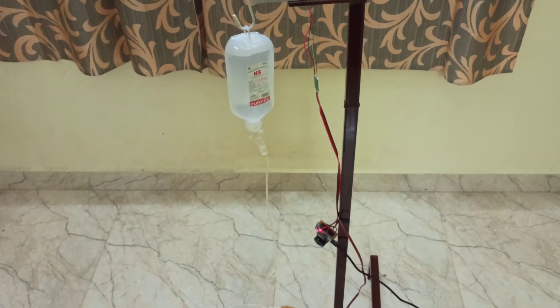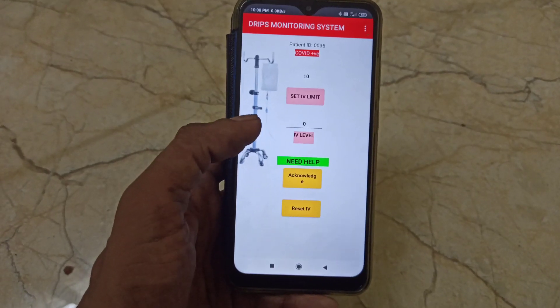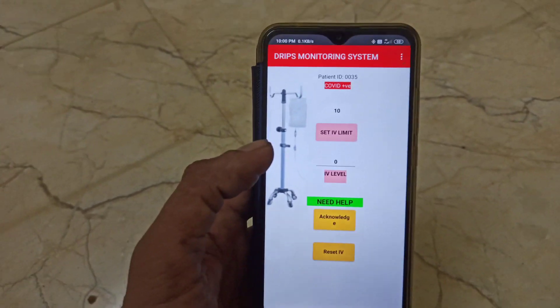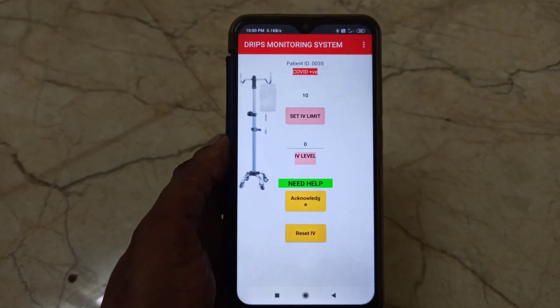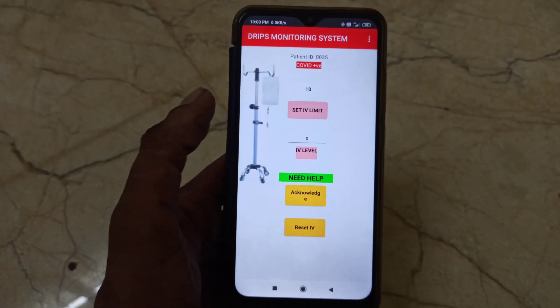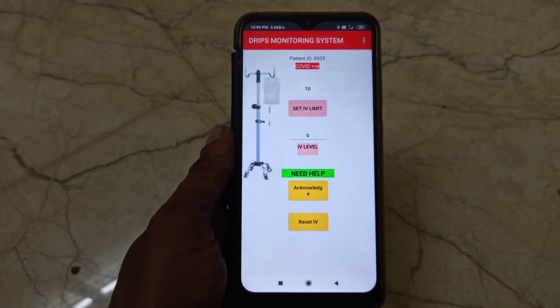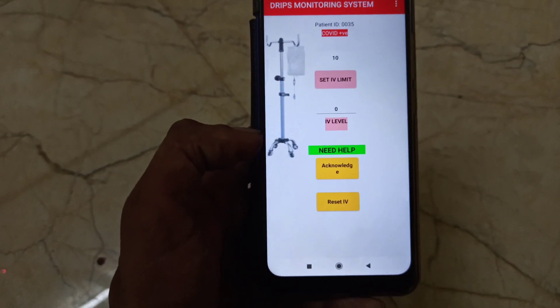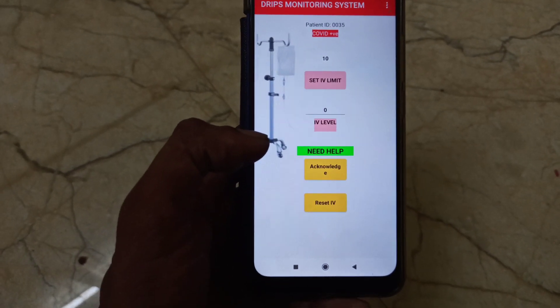Now we can see the demo. I have developed this mobile application. This application works through the internet. In the first text box we can set the level of glucose to be injected to the patient, and in the second text box it shows the current level of glucose remaining in the bottle.